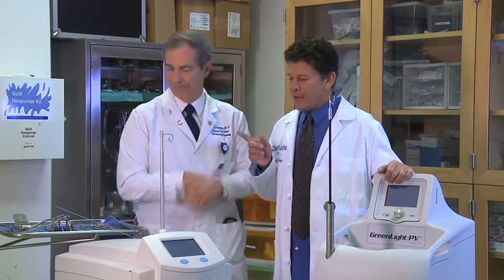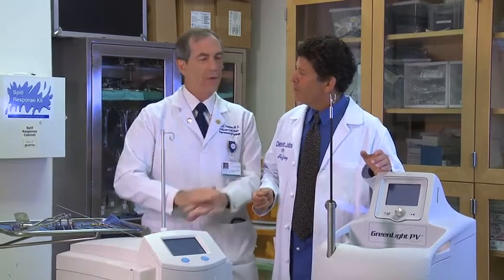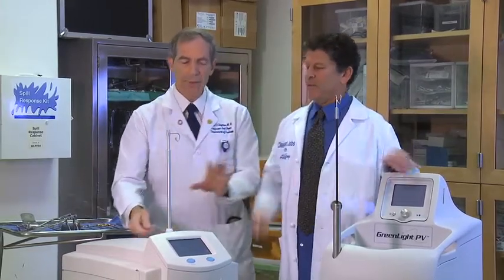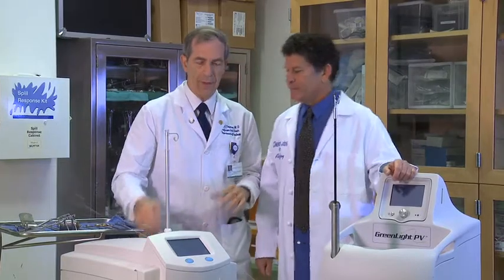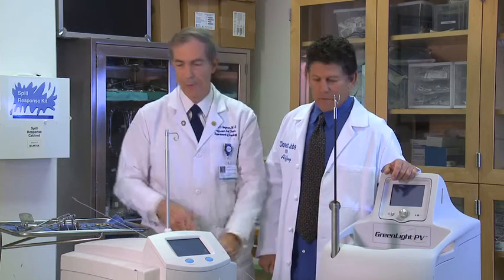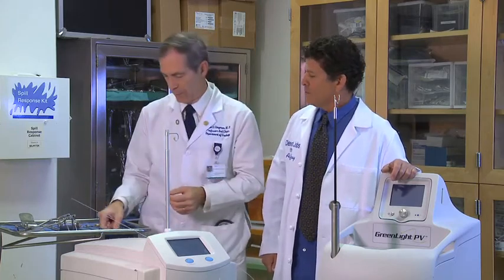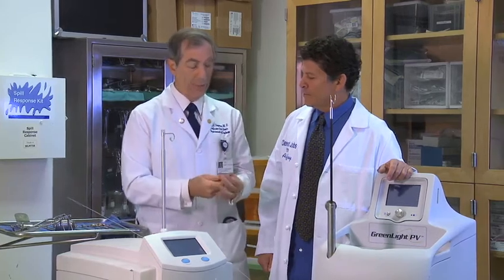So on that point, is that what the Da Vinci does? Now the Da Vinci is a whole different thing. These are instruments that have a specific purpose, for destroying tissue, destroying a stone. The Da Vinci represents a whole paradigm shift. That emanates from where we started out, which is with this, which is still used today.